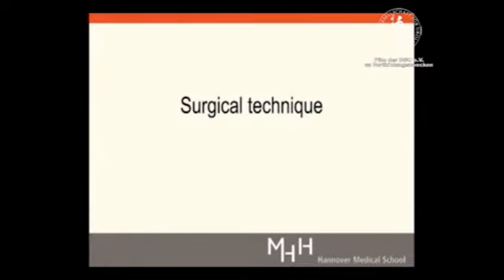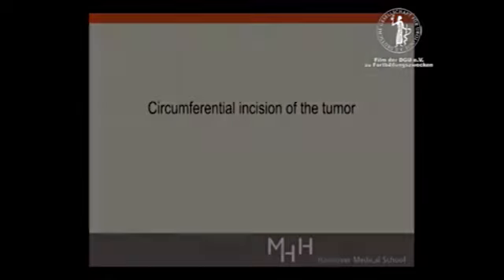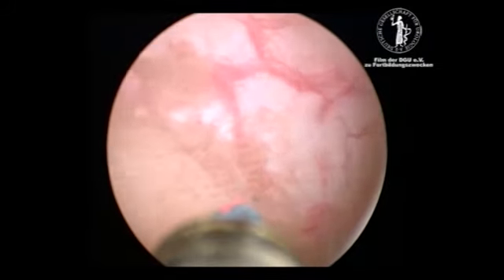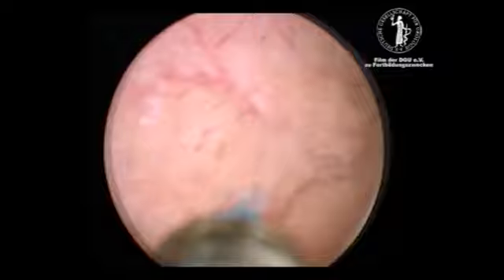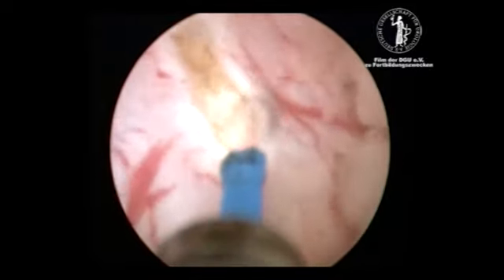Surgical technique. Circumferential incision of the tumor. First, a circumferential incision around the tumor using the laser energy is carried out.